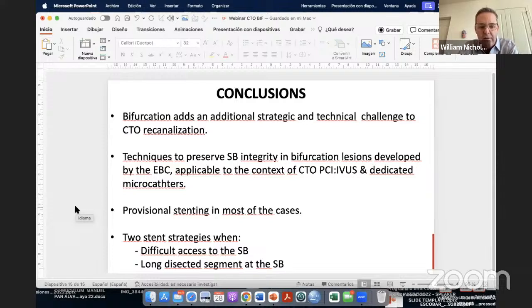We sort of straddle that, and then take a jacketed wire like a Gladius and fold it upstream, and it sort of forces it out into the side branch. And so you can STAR into the side branch and then balloon that length and reestablish at least flow to it, maybe not the ability to end up with a beautiful bifurcation stent at the end. But I struggle with that because I don't have a way of knowing where to actually dig.